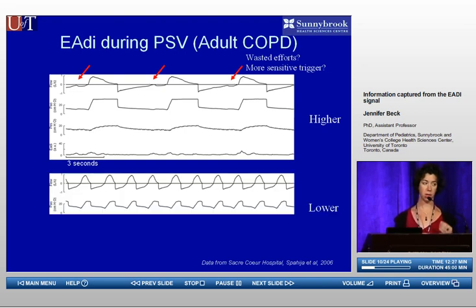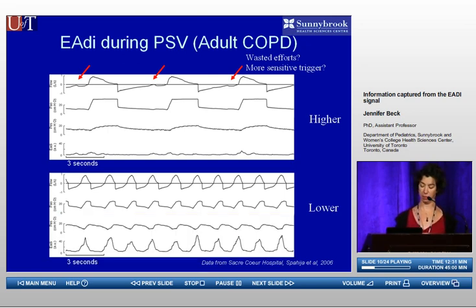We saw an immediate increase in the respiratory rate to 30. But we also saw that just by lowering the assist by 7 centimeters of water, at least in this patient, we were able to get the respiratory drive to come up just a little bit and just enough to successfully trigger each breath. So the point I wanted to make with this slide is that sometimes in pressure support, you can over-assist to the point where you reduce the drive so much that they fail to trigger.